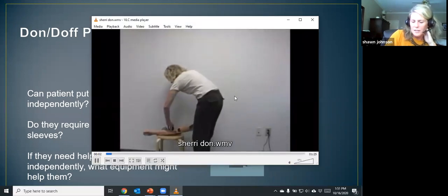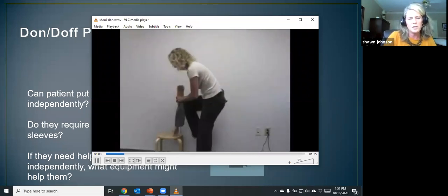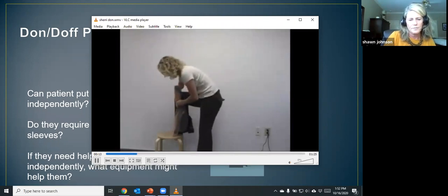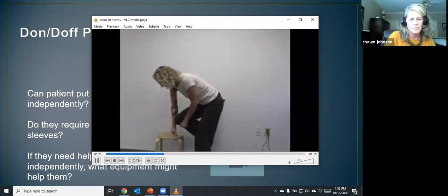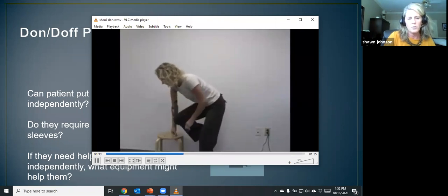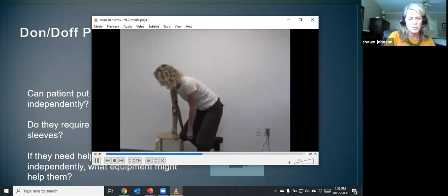I like this. It's an example of an above elbow using a pull sleeve to get into her prosthesis, to use suction with no harness. And with a weighted end, so it'll guide through the pull hole. And at home, she might do it completely differently. This was just a video we were trying to set up in a workspace, and she was able to adjust by finding a little stool nearby where she would be able to do this by herself.